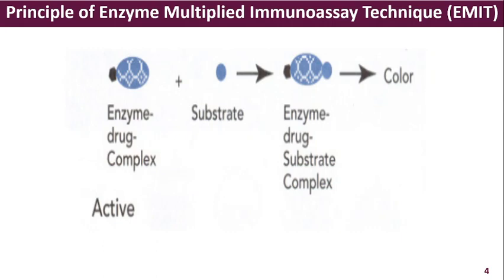Now, this drug molecule, when I refer, it could be a hormone or the drug per se that is used for the treatment purpose, or it could be the hormones that are used by the sports personality for performance enhancement, as well as it could be even the abusive drugs. Like that, you need to prepare a model or the sample depending on what type of investigation you are going to carry out. So therefore, let us take a simple example.